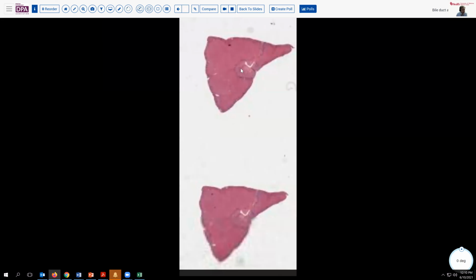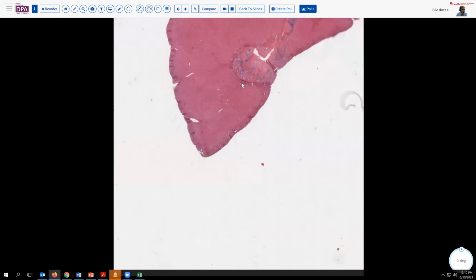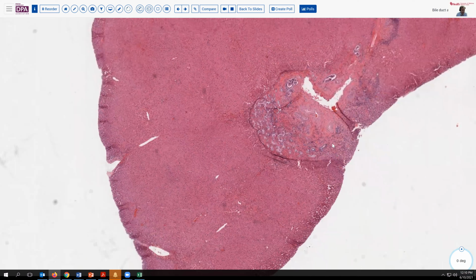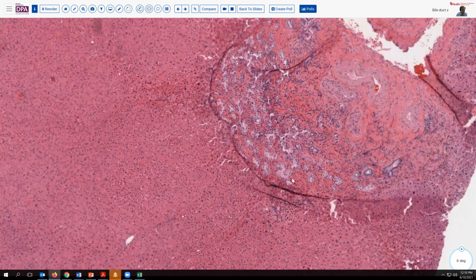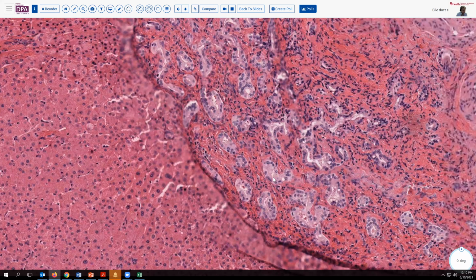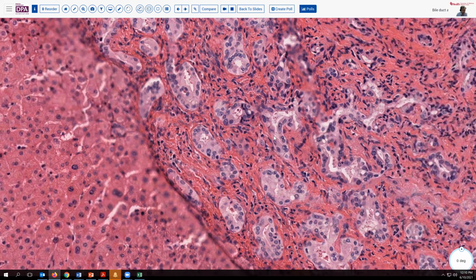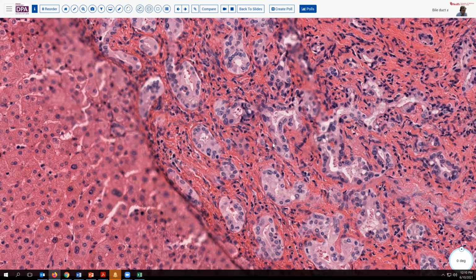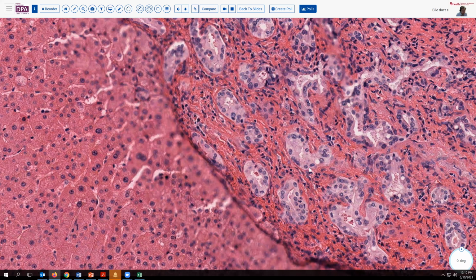Here, the second example, again has a little bit of inflammation associated with it, a little bit of proliferation, and very bland cytology on high magnification, where you've got good fixation to see that these cells have small nucleoli, but they're not particularly hyperchromatic or pleomorphic.